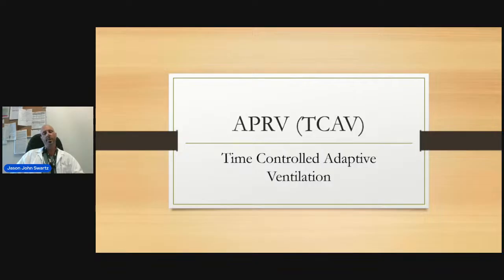And what we're going to do with the time low setting is look at the peak expiratory flow during the release phase, where we're going from P high to P low. We're going to terminate that release when it reaches 75% of whatever that peak expiratory flow was during the release. So it's a very brief release, then we return right back up to the P high.